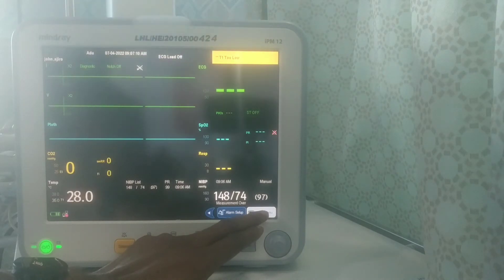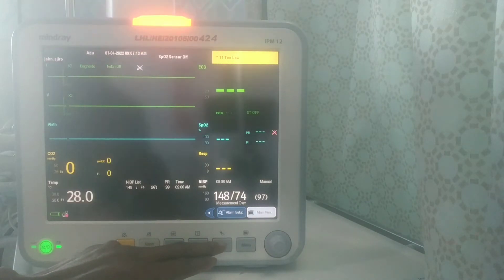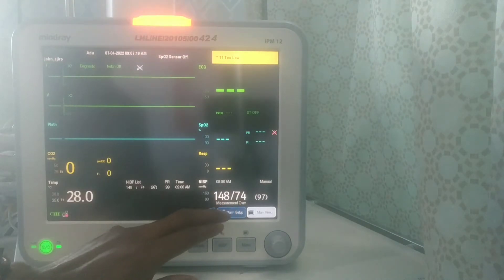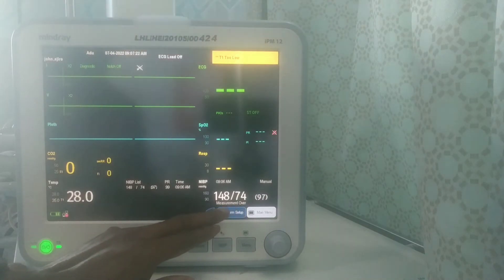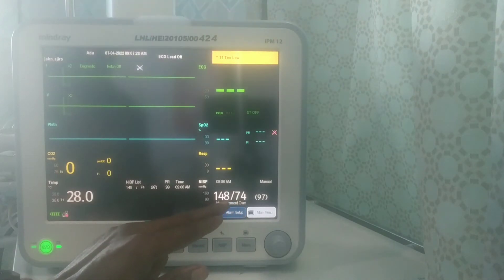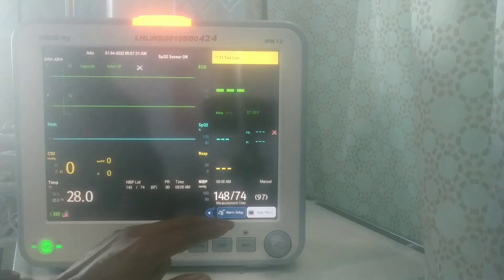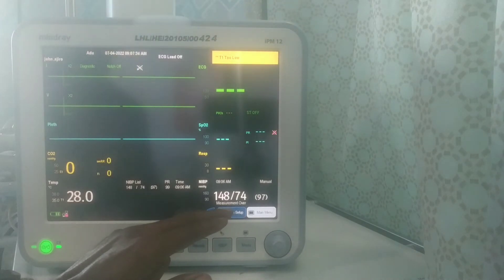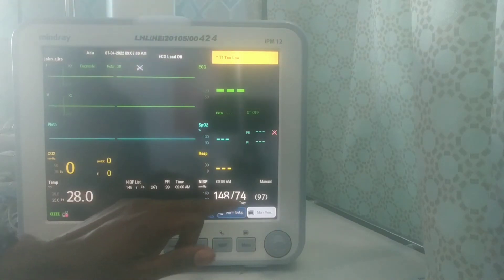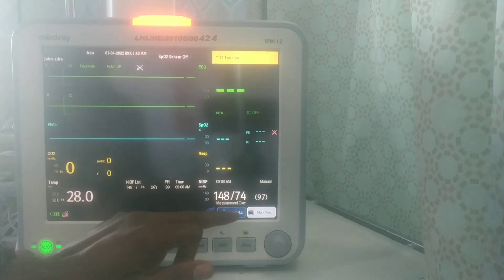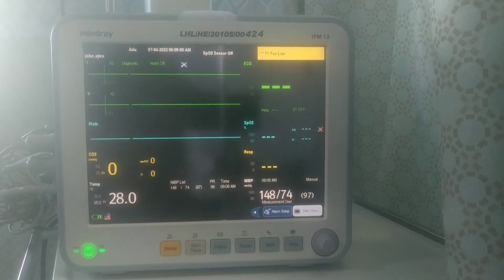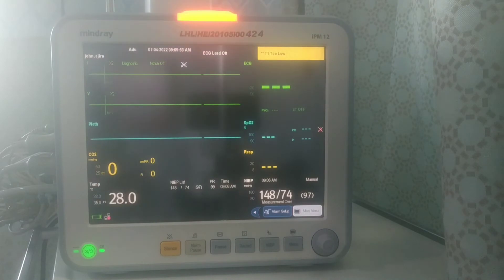After inflating it will deflate, and after that it will display the results. This is the result of my blood pressure: 148 over 74. The reason my BP is a bit high is because I've been moving around. This is where the BP result will always be displayed for you to see.